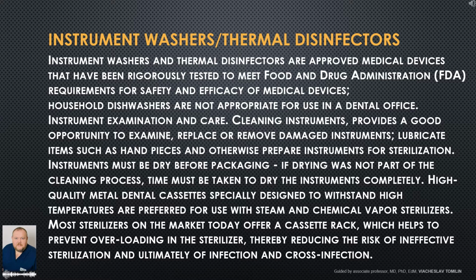Instrument examination and care. Cleaning instruments provides a good opportunity to examine, replace or remove damaged instruments. Lubricate items such as handpieces and otherwise prepare instruments for sterilization. Instruments must be dry before packaging. If drying was not part of the cleaning process, time must be taken to dry the instruments completely.